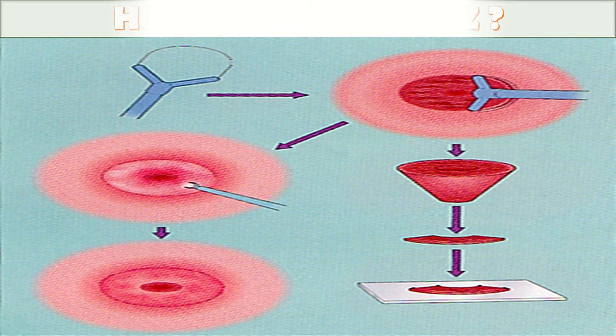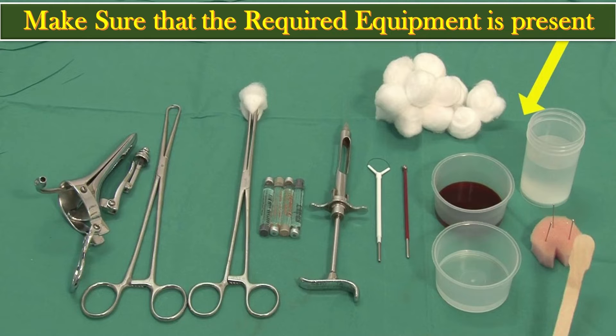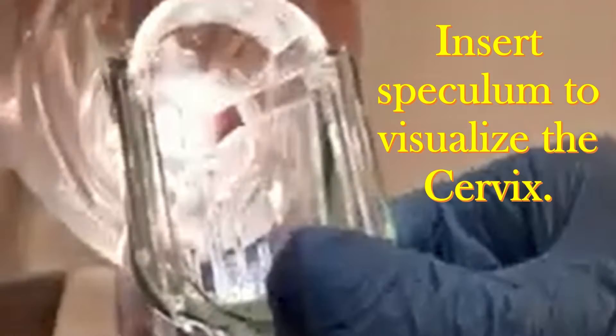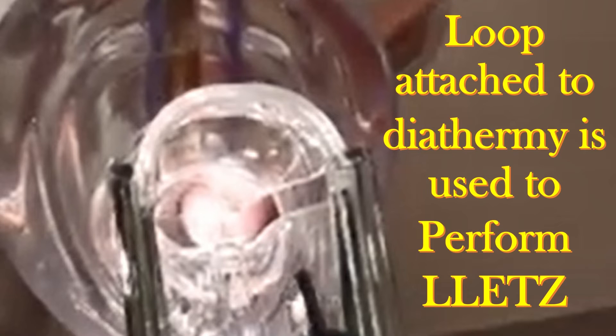How to perform large loop excision of the transformation zone: First, ensure the required equipment is present. After taking consent, position the patient appropriately and insert the speculum to visualize the cervix. Inject local anesthetic into the cervix. A loop attached to diathermy is used to perform the excision. Once complete, watch for any bleeding and remove the speculum.